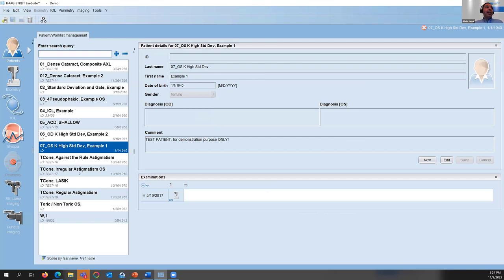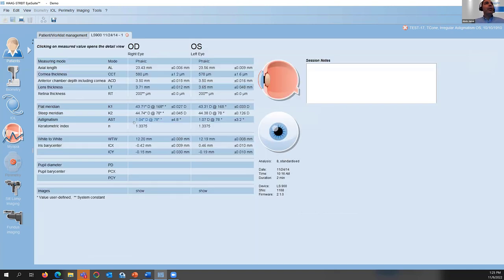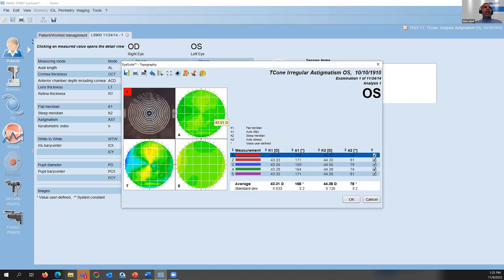Let's take a regular astigmatism case. Here we have one diopter of astigmatism in both eyes and the axis standard deviation is within range, so this could be a candidate for toric implantation. However, when we look at the topography, we see this is not a symmetrical regular topography, so we have to exclude this patient from toric implantation.